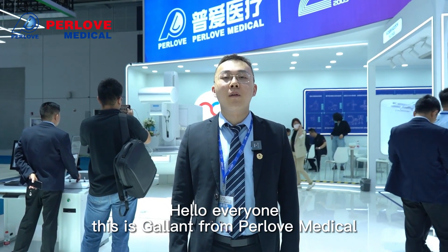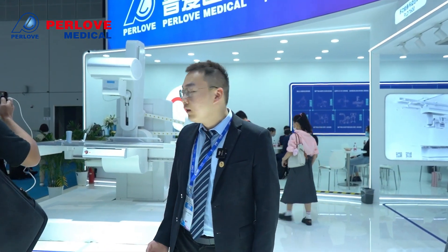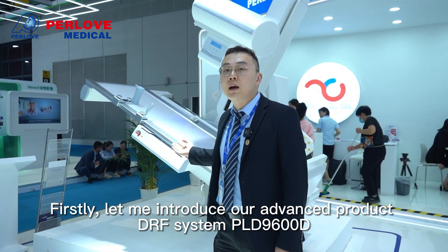Hello everyone, this is Gallant from Perlove Medical. Today it's my great honor to take everyone on a visit to our exhibition stand. Firstly, let me introduce our advanced product, the DRF system PLD9600D.